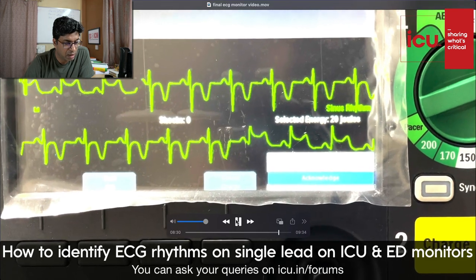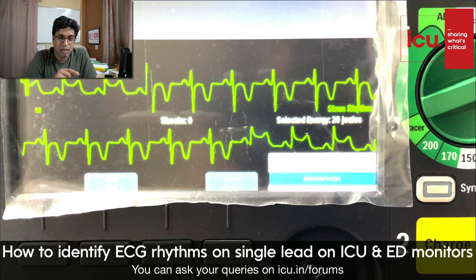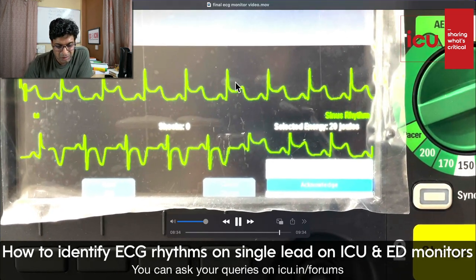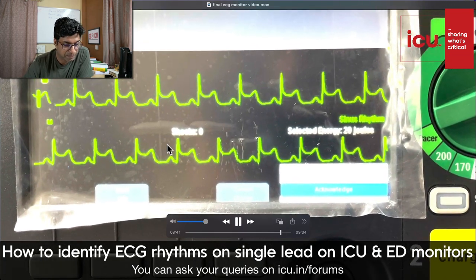Okay, so here the ST has elevated. See, but it's a concave ST. Usually the concave ST elevation is seen in pericarditis. In an MI patient, there is a convex ST elevation. But on a single strip ECG, it's very difficult to identify whether it's pericarditis or MI. For all practical purposes, if you see an ST elevation on the ICU monitor, then you should consider it a sign of MI and should intervene immediately. Go for a 12-lead ECG. Okay, so the pattern is of pericarditis, but we'll consider it as an MI because it's a single strip.